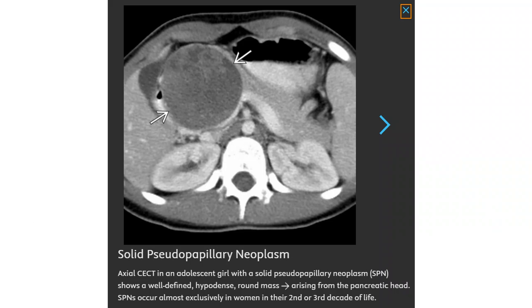This is a contrast CT in an adolescent girl with a solid pseudopapillary neoplasm, showing a well-defined hypodense round mass arising from the pancreatic head. It occurs almost exclusively in women in their second and third decade of life.